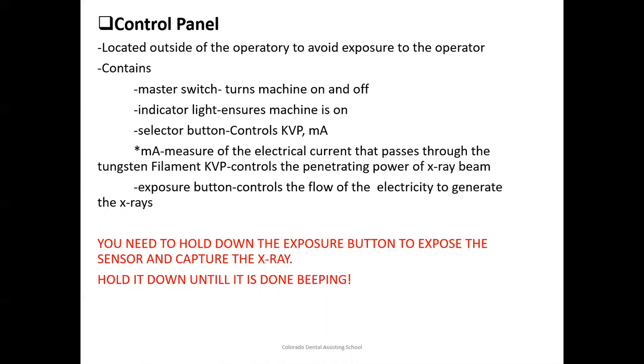You want to remember to hold down the button all the way until it's done beeping. Please don't push it really quickly and walk away. It will send an error code and then we have to start over. So just remember that button will require that you hold it down all the way and wait. It will continue to beep. Once it's done beeping, you can let go and go reposition the sensor in the patient's mouth.